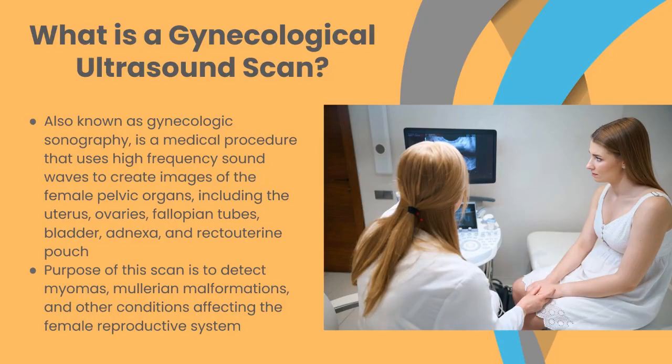What is a gynecological ultrasound scan? Also known as gynecologic sonography, it's a medical procedure that uses high-frequency sound waves to create images of the female pelvic organs, including the uterus, ovaries, fallopian tubes, bladder, adnexa, and rectouterine pouch. The purpose of this scan is to detect myomas, Müllerian malformations, and other conditions affecting the female reproductive system.